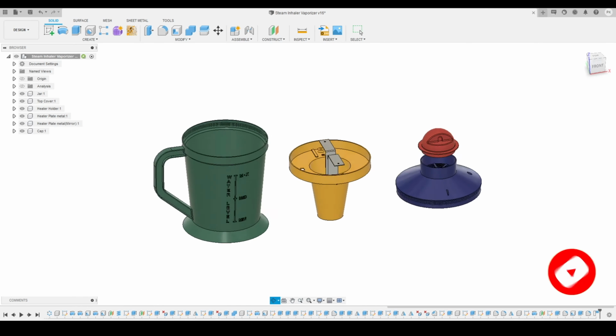Now if I delete this dimension, you can see the sketches are again turning blue because it is not defined. So I will just put the dimension back to make it completely defined. This way you can make your sketch correctly. Now I can click on finish sketch since we are done with this sketching part. So I will go over here and click on finish sketch.